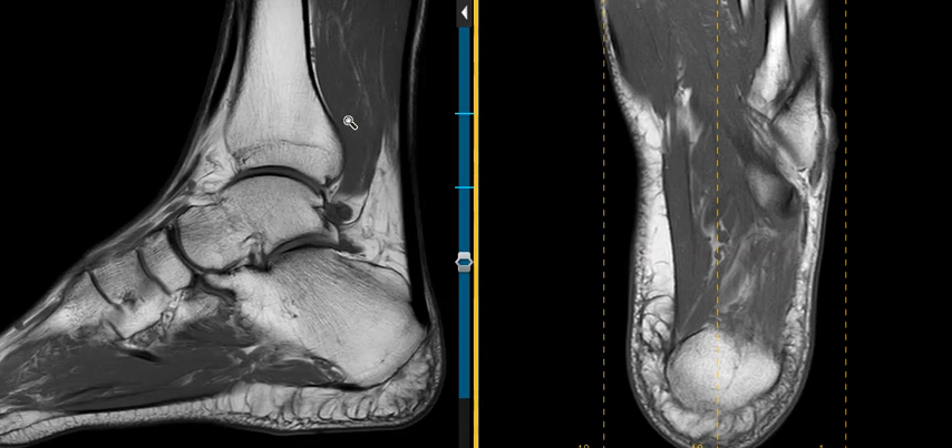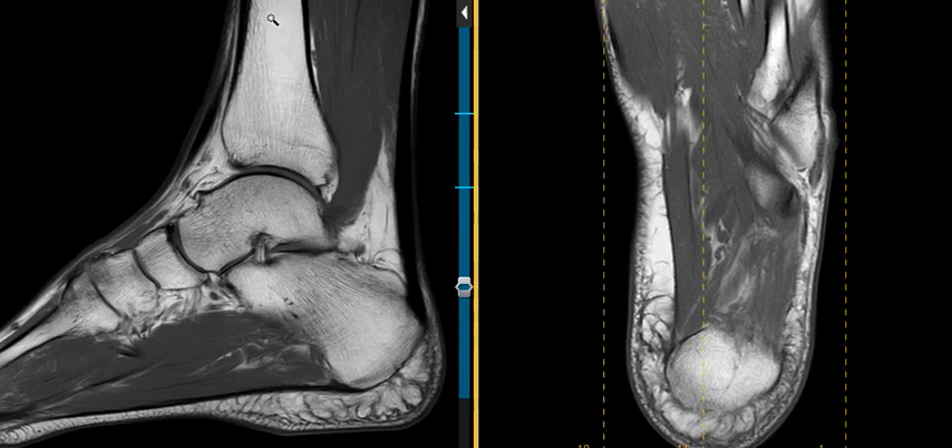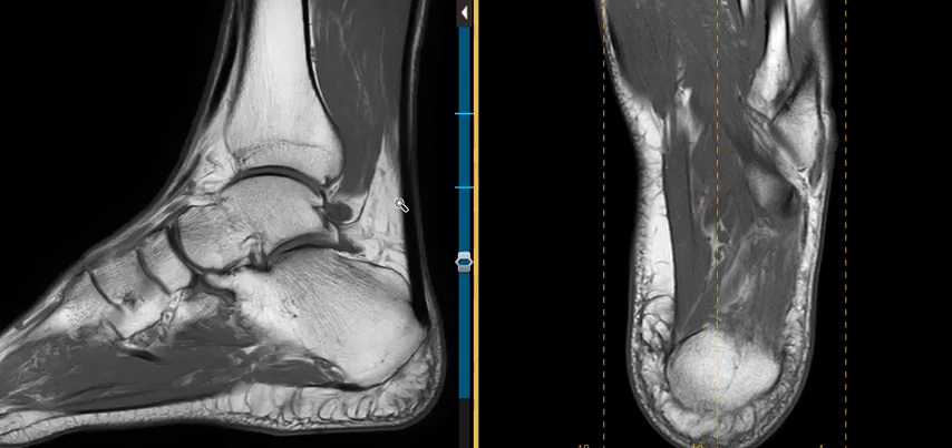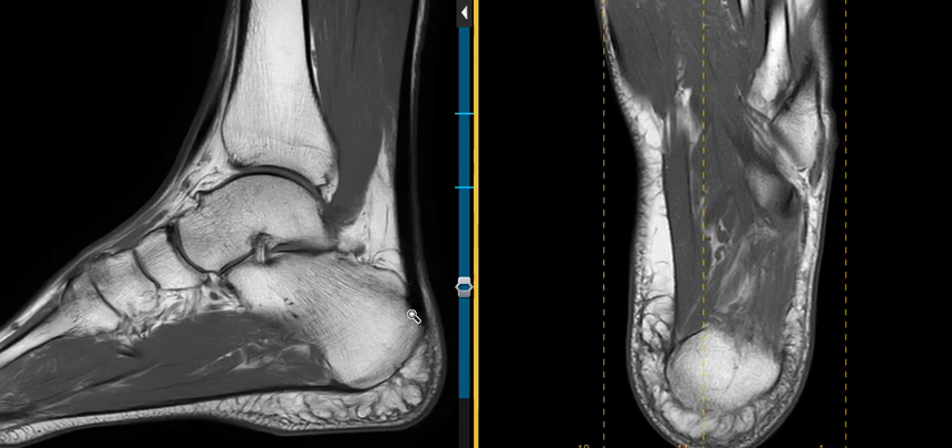His pain is most pronounced laterally, and on this sagittal view we see the tibia coming down. We see this rounded area along the roof of the talus — this is called the talar dome. This is the tibiotalar joint, the ankle joint, looking normal. This is the calcaneus, looking normal. This is the Achilles tendon looking great, and we have the plantar fascia down here looking great.